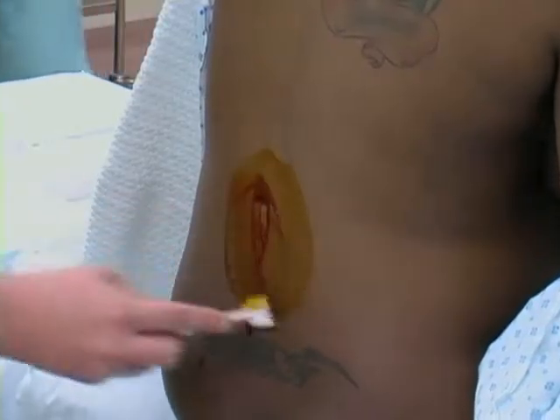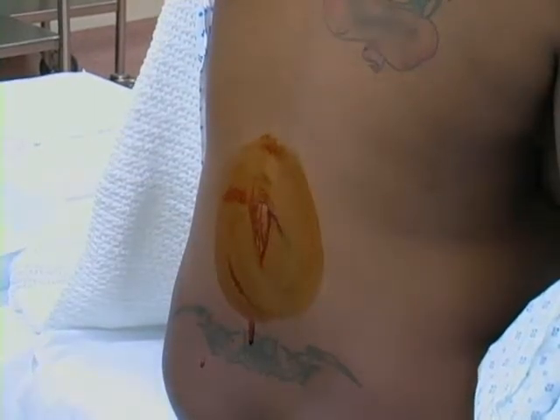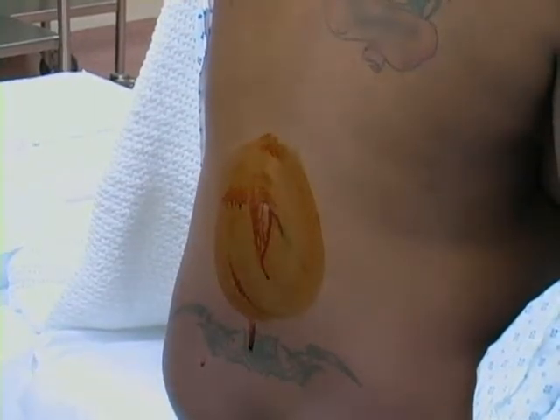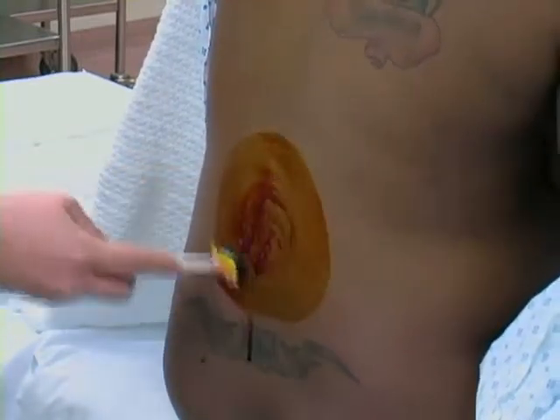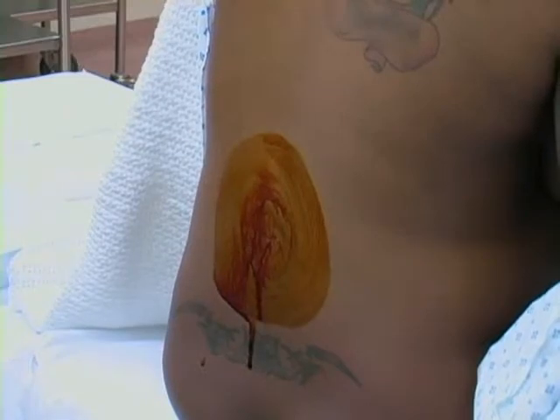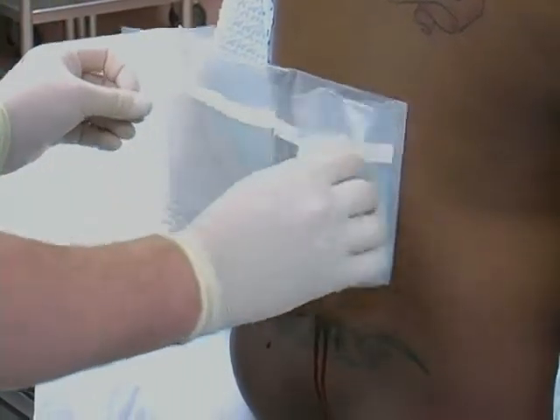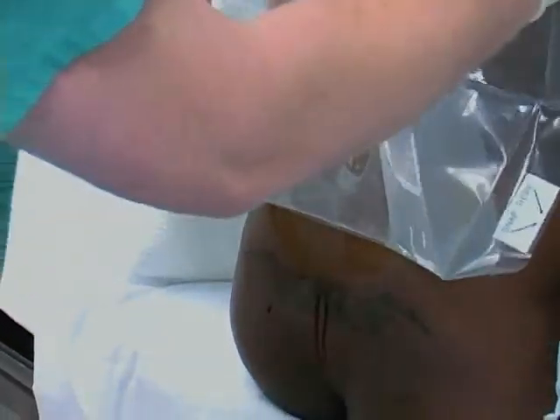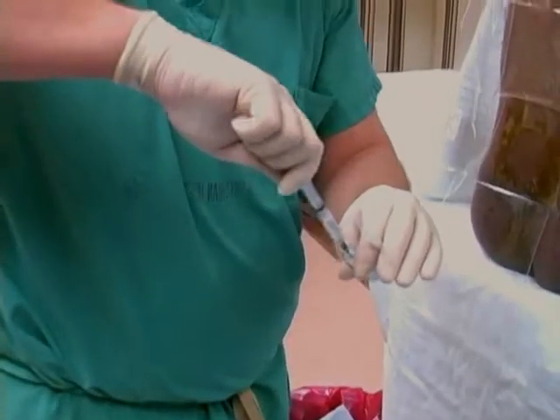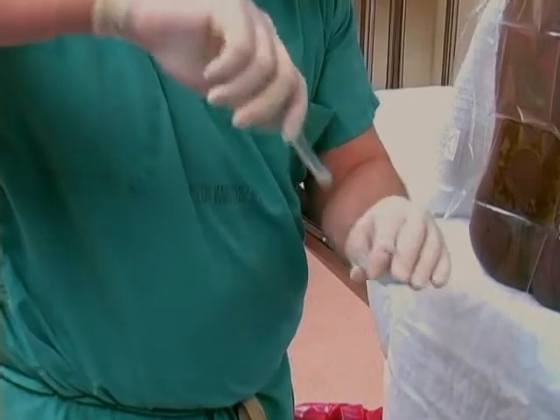Once a lumbar interspace is identified, cleanse the area with betadine solution, wiping in concentric circles. Repeat this process 3 times. Allow the betadine to dry before inserting the needle. Place a sterile drape on the back, with the pre-cut opening centered on the vertebral interspace that will be used for needle placement. Using a sterile syringe, draw up 3 milliliters of 1% lidocaine.